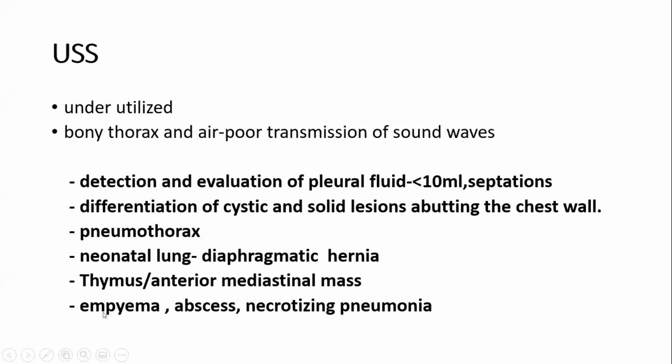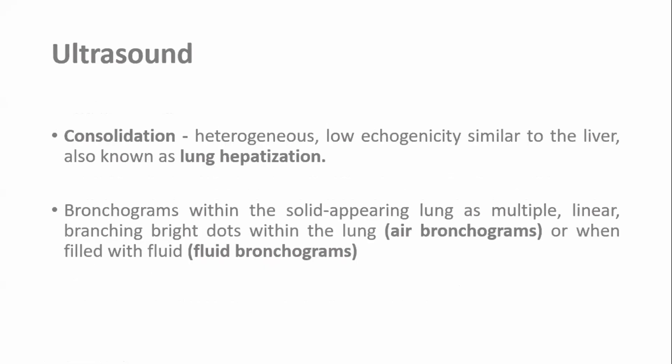Then, as I said earlier, empyema, abscesses, necrotizing pneumonias, all these in children you can diagnose because most of the lung is close to the surface, unlike in adults. But if you need further clarification, of course, you have to go for a CT.